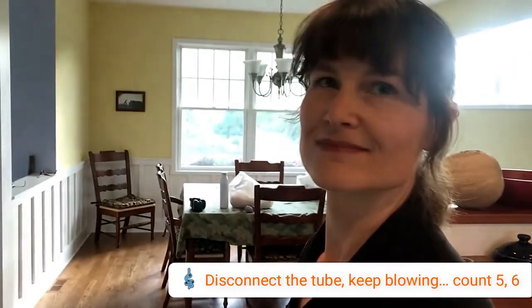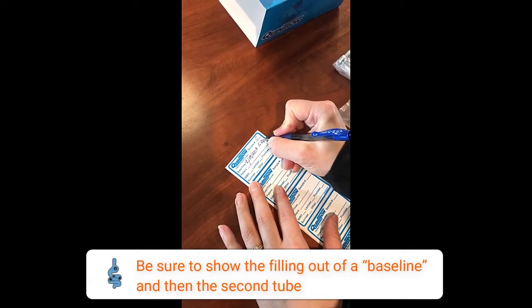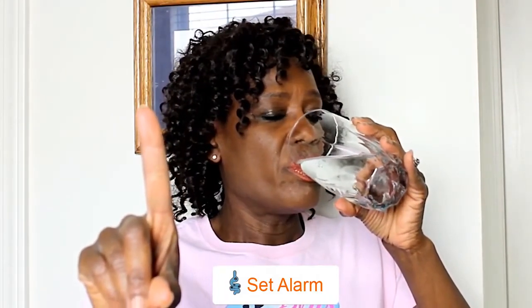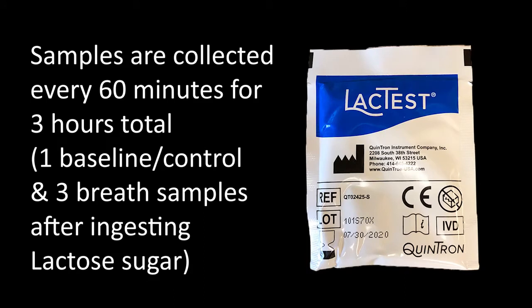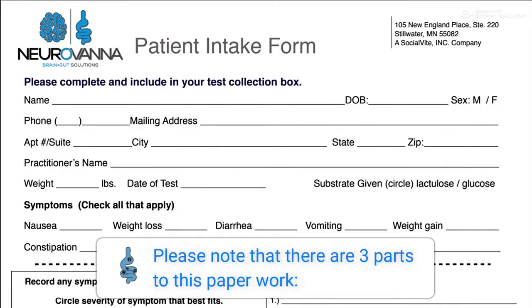After each breath sample collection, fill out a label including the specimen number and time collected. Once your baseline breath sample is collected and the label is completed, you can now drink your test solution sugar substrate and set your timer or smartphone for your test-appropriate time interval. Neurovanna offers a variety of sugar substrates — please follow the included directions that detail the amount of water required. This is a good time to fill out your enclosed Neurovanna patient test form.